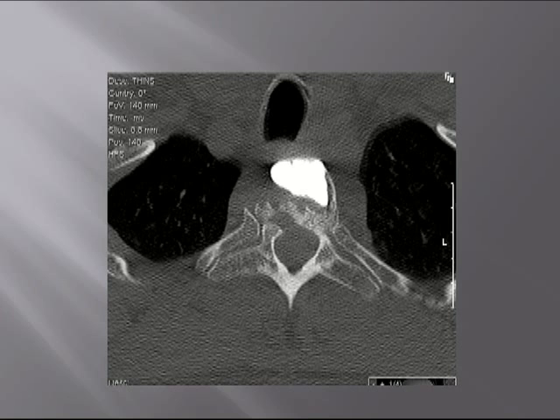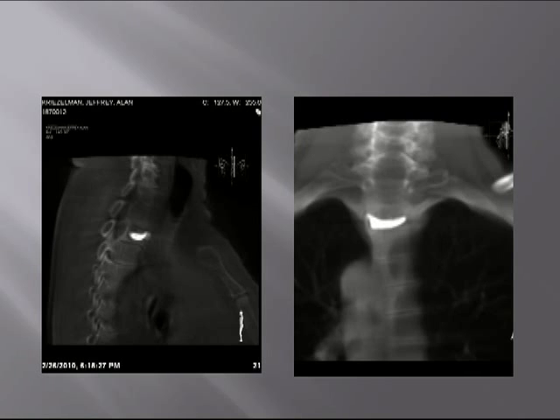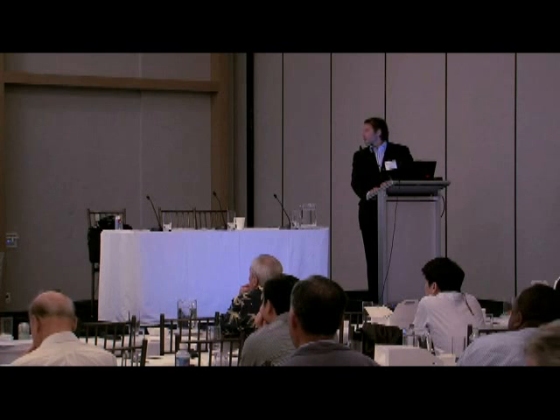This can be, as I said, pretty well controlled, and over a very long injection can be kept inside the vertebral body without any leakage to the paraspinal tissues or into the epidural space.